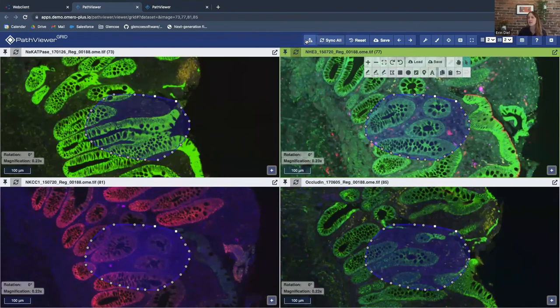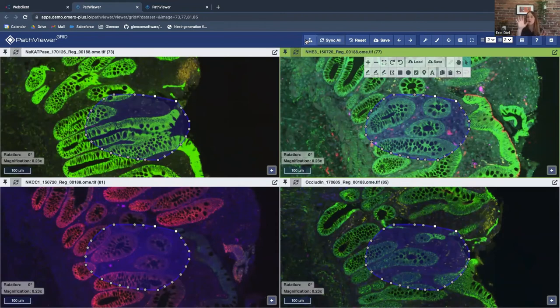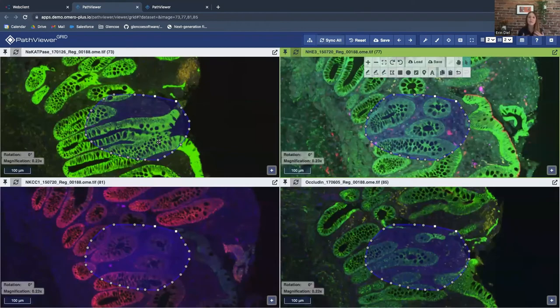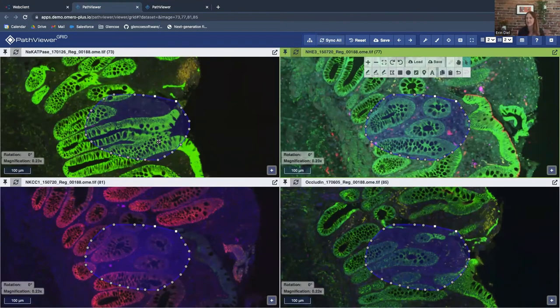If I were to annotate one of these regions, I can annotate in one image and then copy and paste to all. This cuts down on the work if you are annotating a number of images at one time. Another useful case for PathViewer Grid: if rather than separate images you have one of those highly multiplex datasets with tens of channels, you can use PathViewer Grid to view one image copied across multiple panels, turning on and off different subsets of channels within each view — maybe three to five channels or even a single grayscale channel per panel. It's a really nice way to navigate very rich single images when you can't appreciate all 50 channels in one viewer.